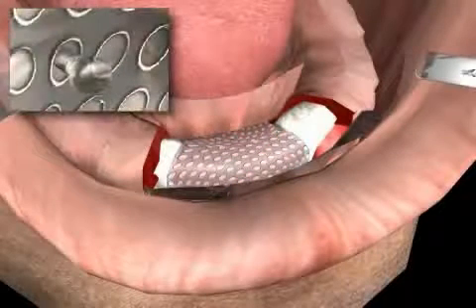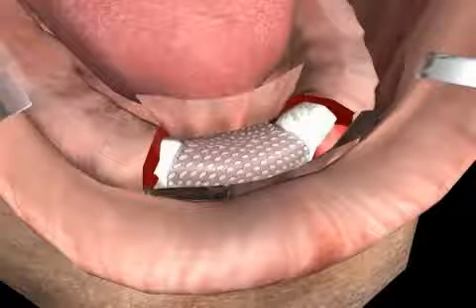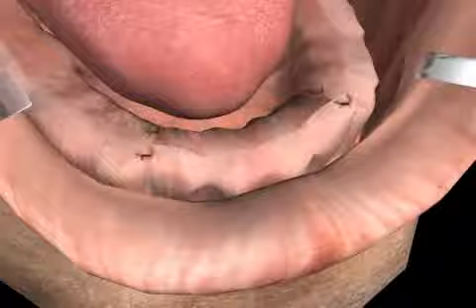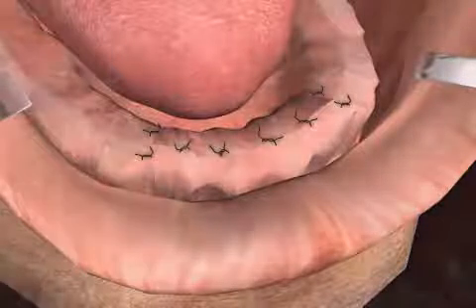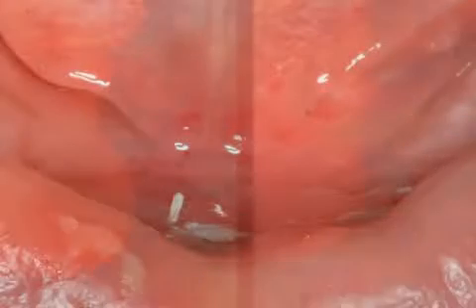Finally, the PLA foil is fastened to special pins in the bone, which are biodegradable. Now the wound is sutured so that saliva cannot enter it. 1 week after surgery, the wound has healed well. One can still see the suture material. In the lateral image, you can clearly recognize the positive change in the facial profile resulting from the bone augmentation.